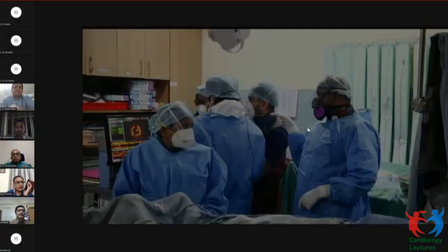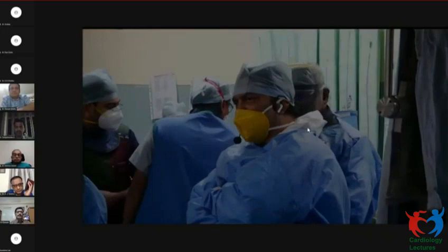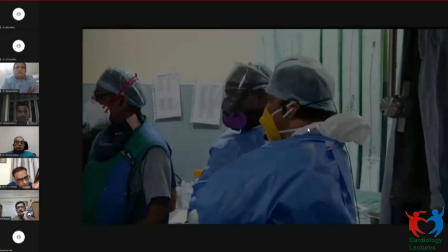What are you planning? No, our strategy is the patient is having an LM ostial disease and LAD D1 bifurcation lesion. The LAD diagonal ostium is very, very critical. And even if I do provisional stenting, the closure is very, very likely because of the eccentric calcium at the LAD D1 bifurcation. So initially our intention is to do the DK crush stenting of the LAD D1 using a 2.25 stent into the diagonal and a 3 mm stent into the LAD.